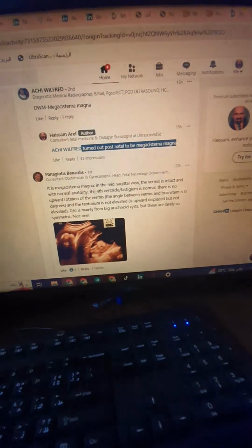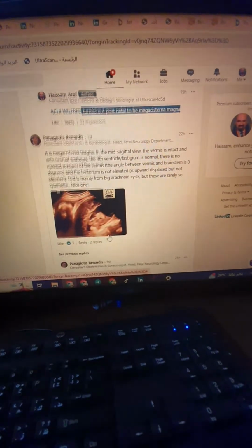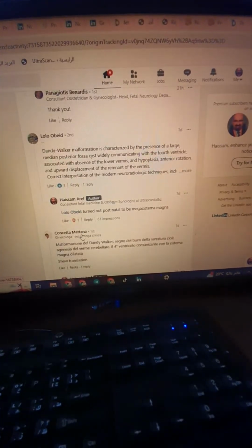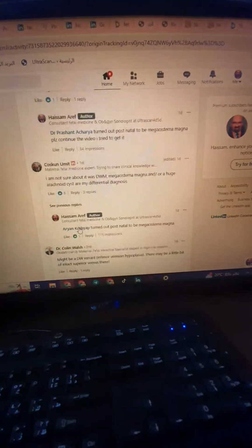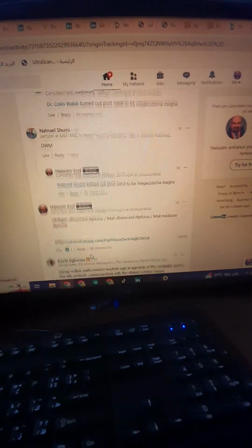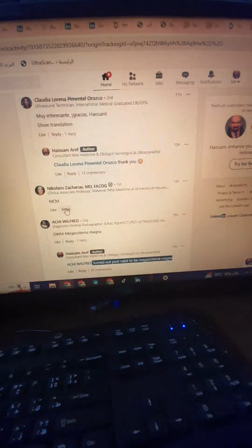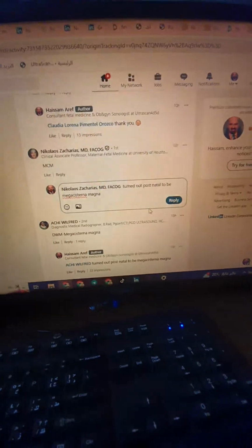It's an amazing comment. It's educational content. We can't thank you enough. Other comments, yes. It's not Dandy-Walker variant. It was postnatal mega cisterna magna. Let's comment here. Yes, Professor, turned out postnatal to be mega cisterna.